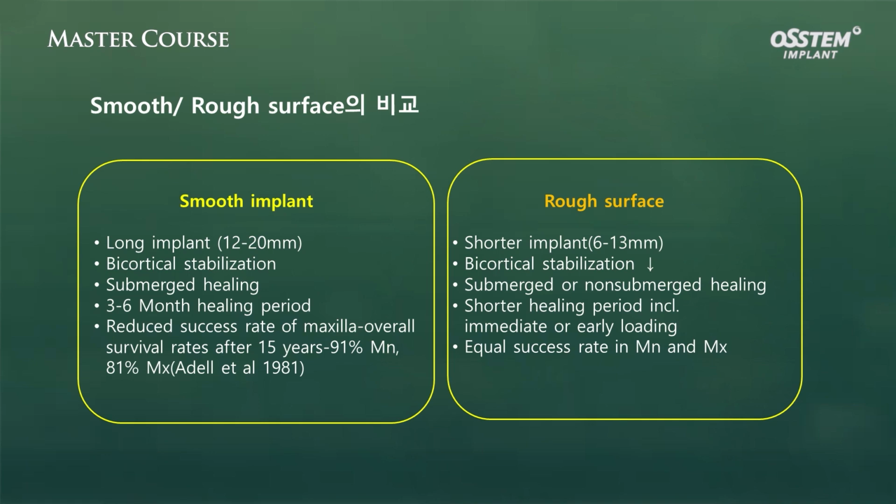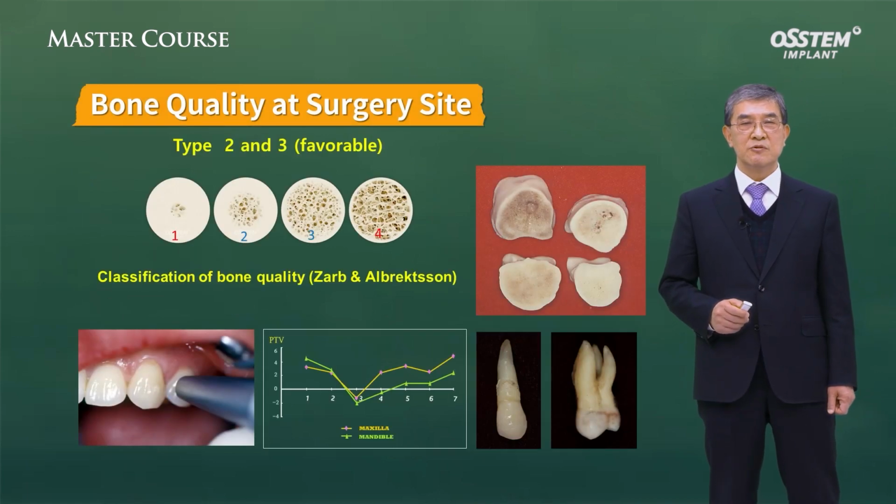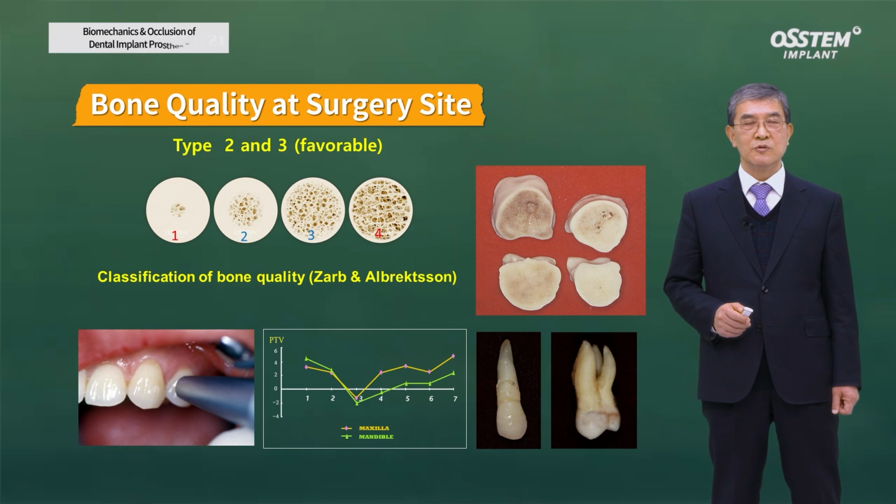If you use rough surface, these days it is very important to use rough surface appropriately. The bone quality of the site in question is also another important factor.